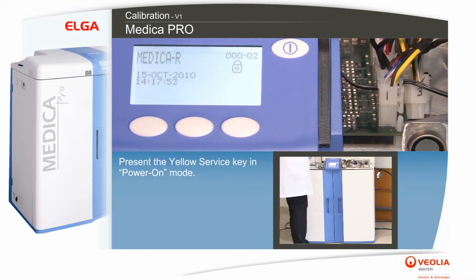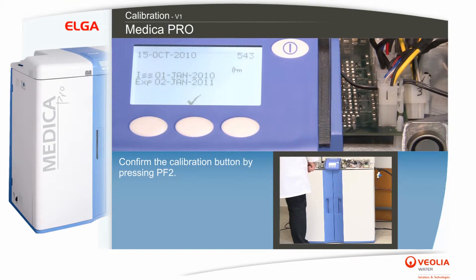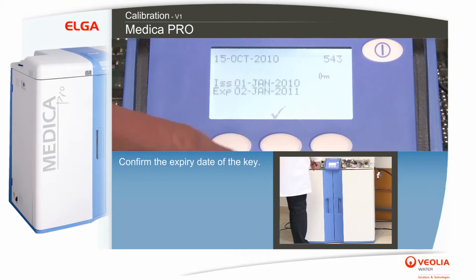Present the yellow service key in power on mode. Confirm the calibration button by pressing PF2. Confirm the expiry date of the key.